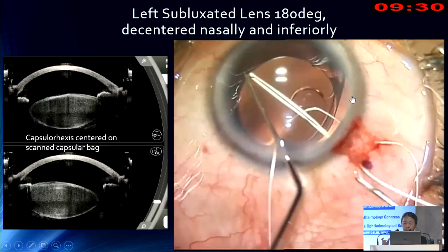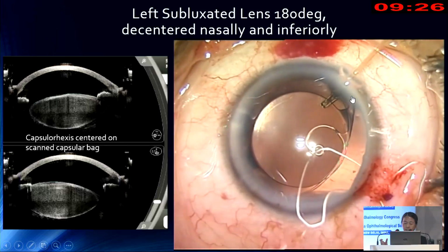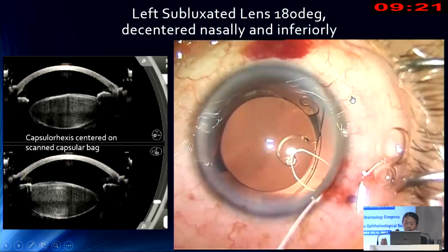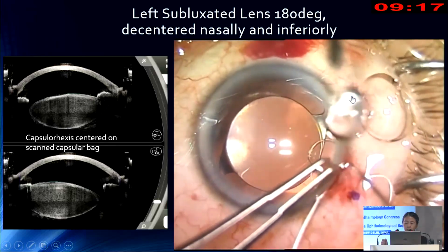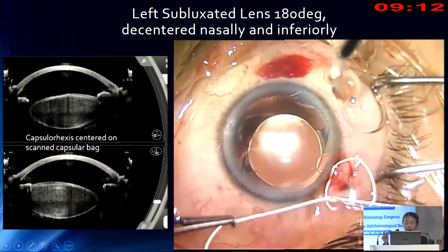You pull back on the needle. All right, so now you have that lasso come out of the main incision. Okay, you leave it a little slack because you're going to hook it out of the Hoffman pocket. You don't want to suddenly pull on that suture. You can see it move, right? So you always leave it a little slack in the anterior chamber, and you look at the IOL for centration.